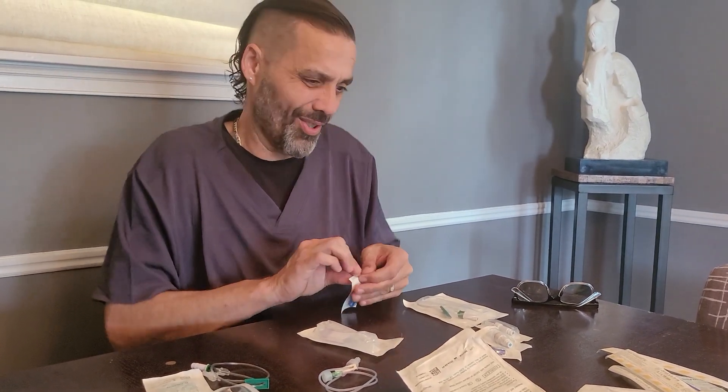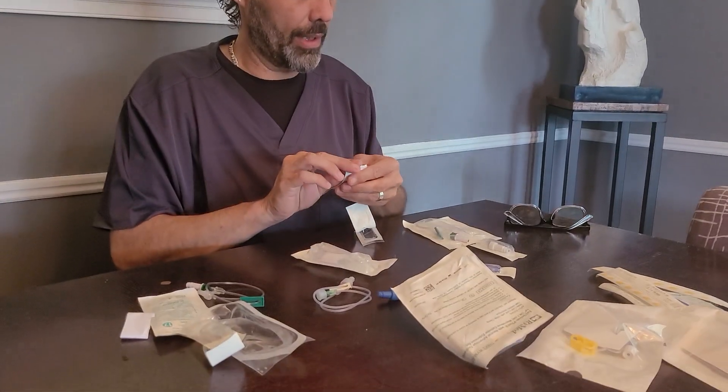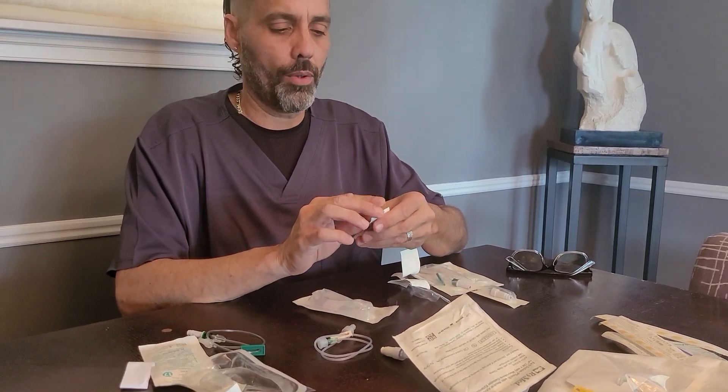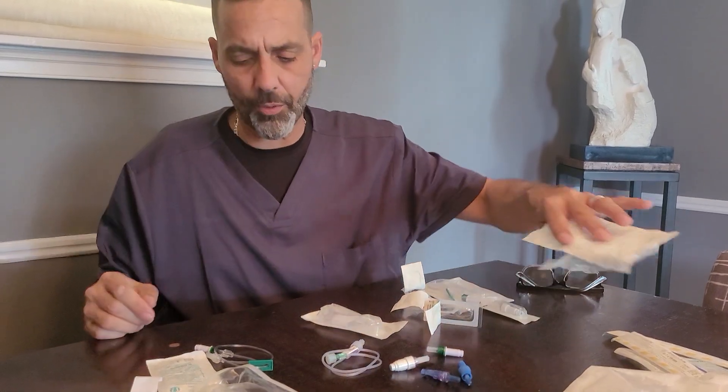Hospital nurses do not use extensions because they do everything for you. But as patients, you've got to do a lot of this stuff on your own after we teach you. That's the whole idea here.